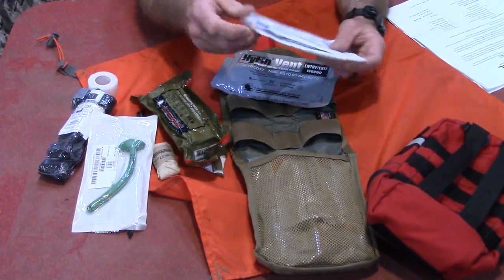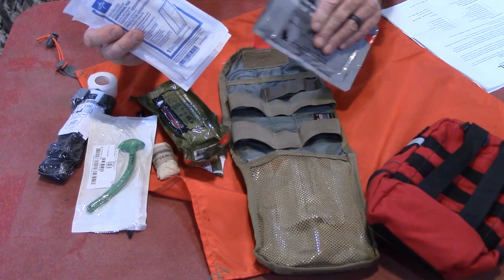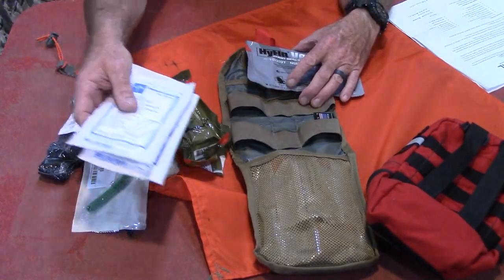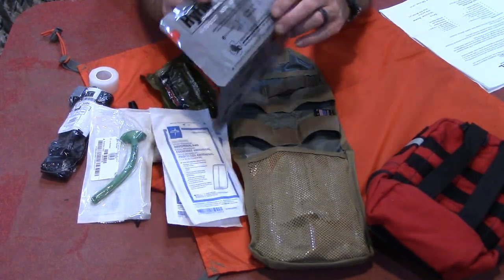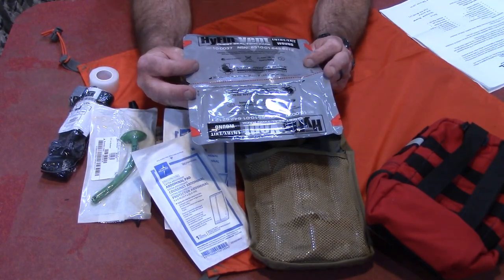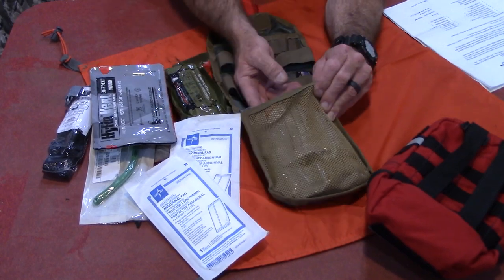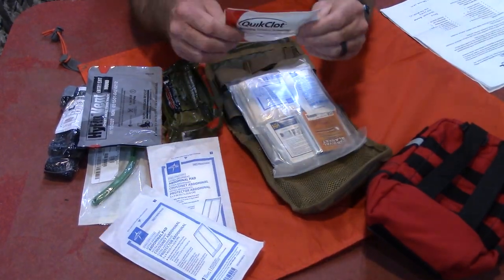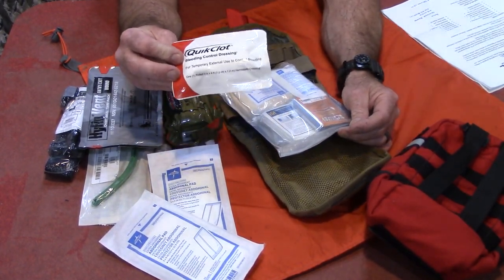We've got two Hyfin chest seals. If you don't know what that's for, I suggest you get some training — but this is for sucking chest wounds, to seal the chest on entry and exit. You need one on front, one on back. Moving on to the mesh pouch, we've got a Quick Clot dressing — that causes clotting so it helps stop bleeding when packed into a wound.